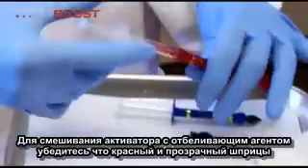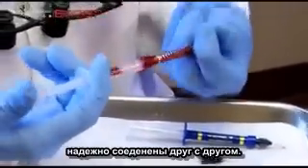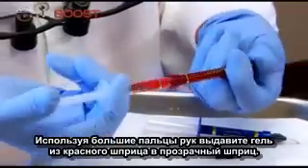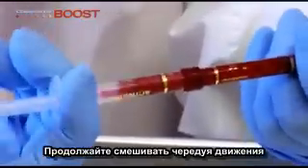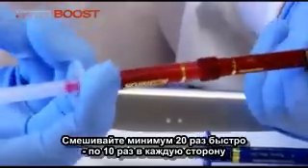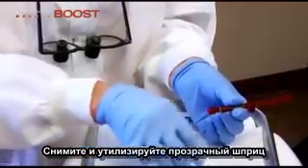To mix the activator with the bleaching agent, ensure the red and clear syringes are securely attached together. Quickly and forcefully press the clear plunger into the middle clear barrel. Using your thumb, press the chemical from the red syringe into the clear syringe. Continue by reversing this action. Mix a minimum of 20 times rapidly, 10 times for each direction or side. Press the entire mixed contents into the red syringe. Remove the clear syringe and dispose.